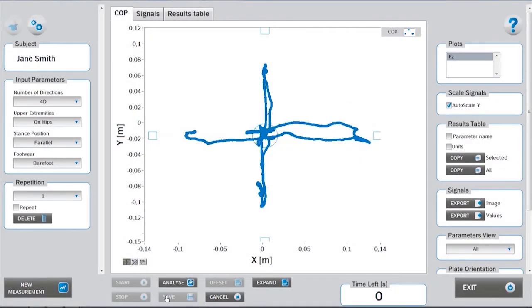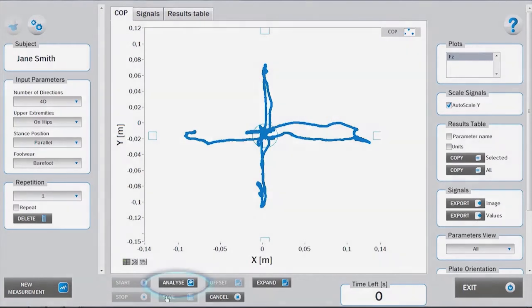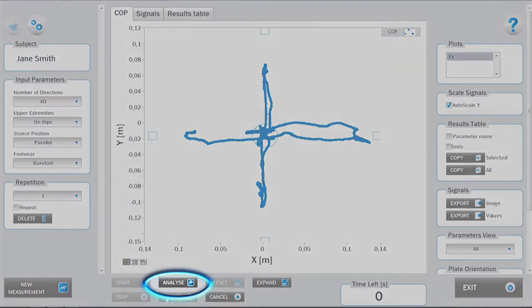The central window displays the COP measured by the force plate. If the settings for analysis were changed after the measurement was completed, you can reanalyze the data by clicking on Analyze.